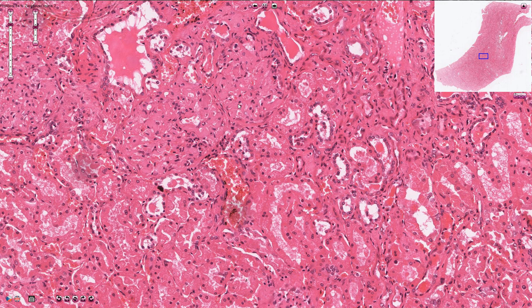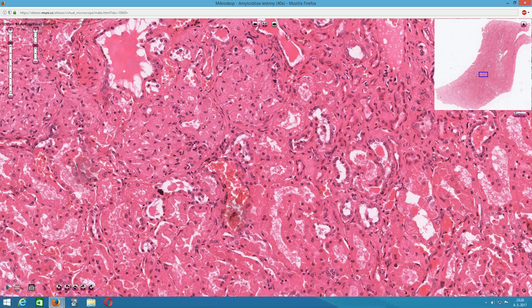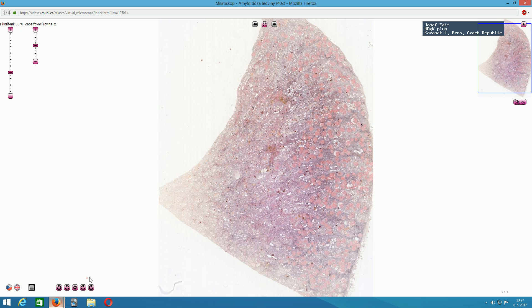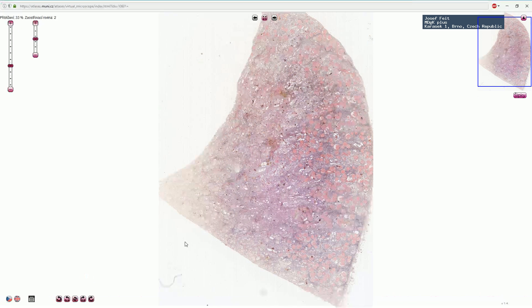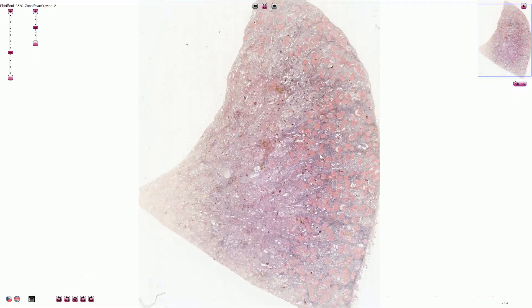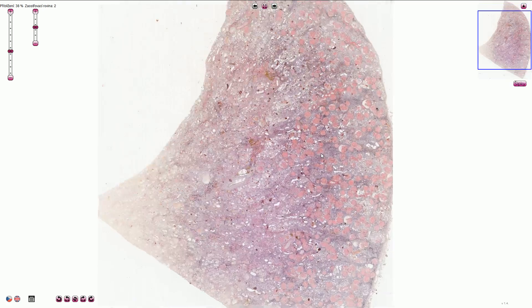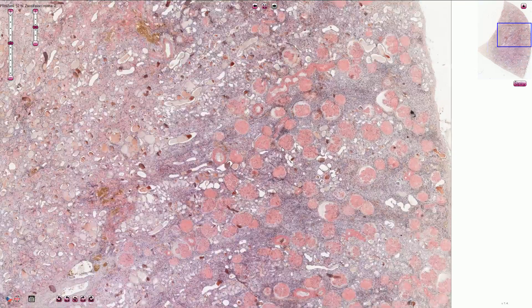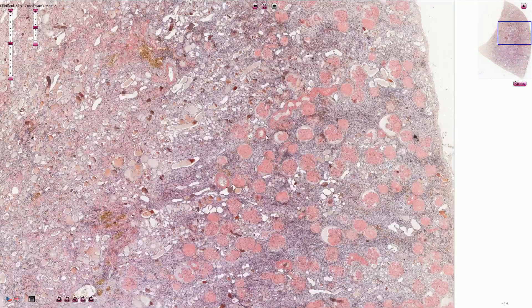That special stain is called Congo red stain. The second slide in our set of slides for the practical part of the exam is a kidney stained by Congo red, and we can see amyloid that affects the glomeruli and also deposits inside the wall of the blood vessels.